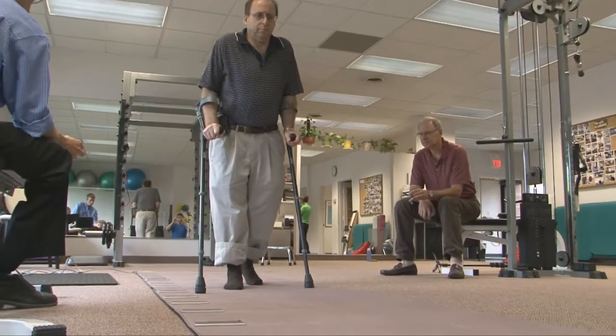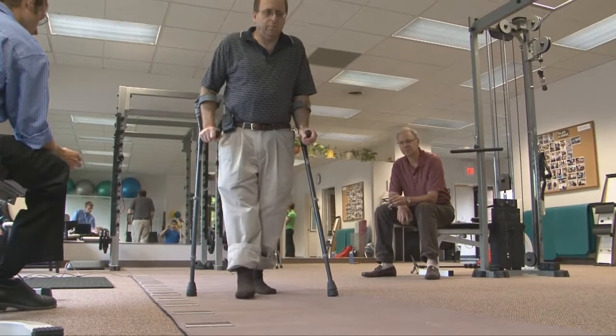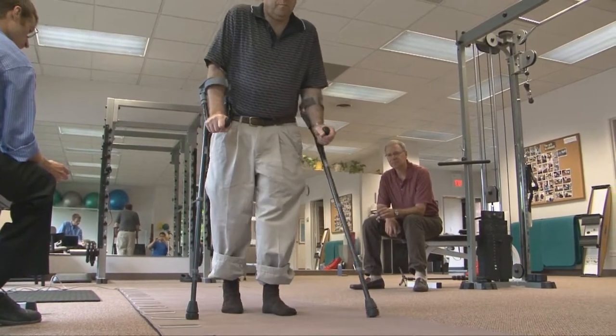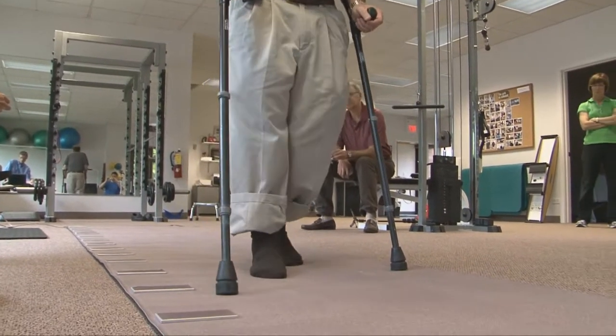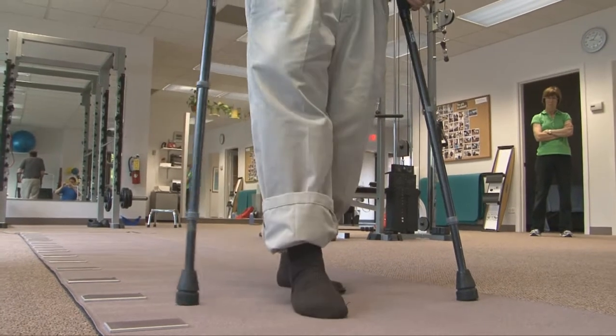If the patient has a fairly standard gait, meaning they aren't dragging their feet across the mat or doing something that would cause the software to not be able to figure out the walking pattern, then usually within a couple of seconds we have the basic gait data in front of us.